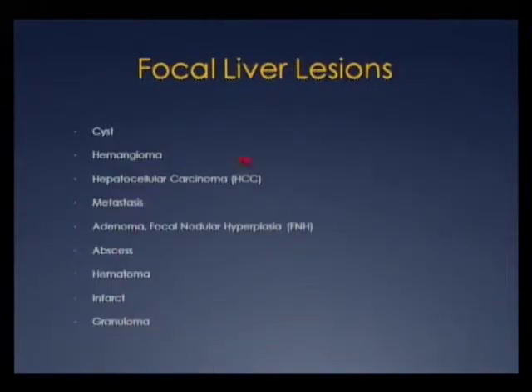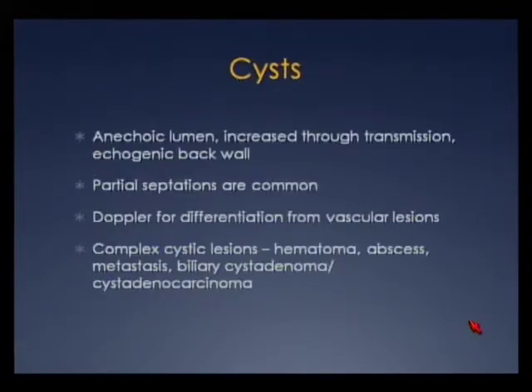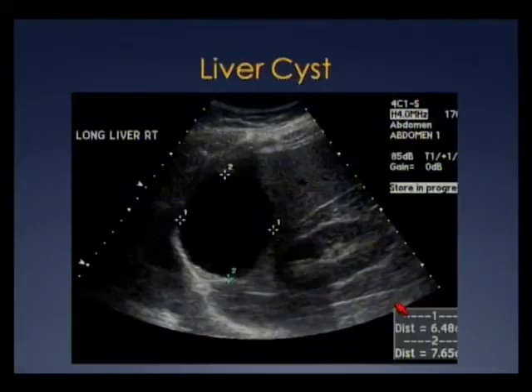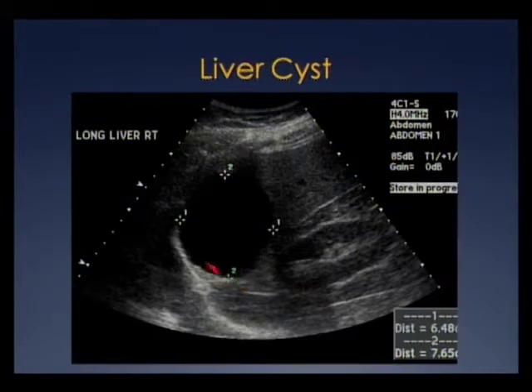We'll review the most common focal liver lesions. Cysts typically have an anechoic lumen, increased through-transmission, echogenic back wall. Small cysts can be harder to discern, so Doppler can help distinguish a small cyst from a vascular lesion. The differential for complex cystic lesions includes hematoma, abscess, metastases, biliary cystadenoma, and cystadenocarcinoma. Here's a large cyst in the right lobe — nearly 8 centimeters — with well-defined back wall, increased through-transmission, anechoic lumen, and a small septation.